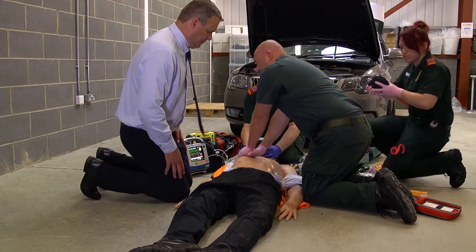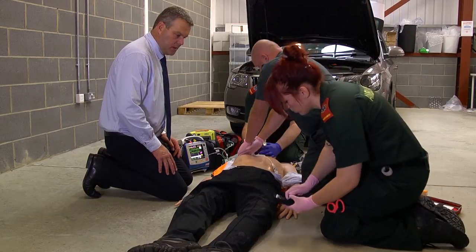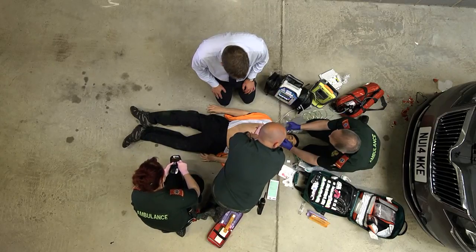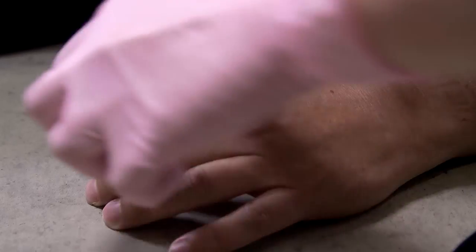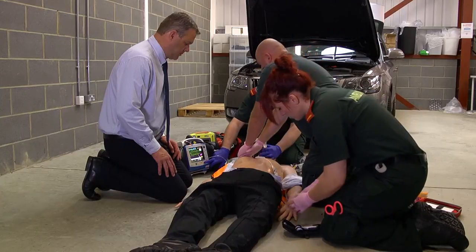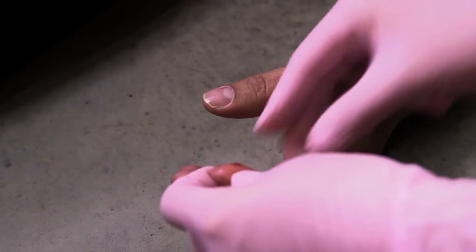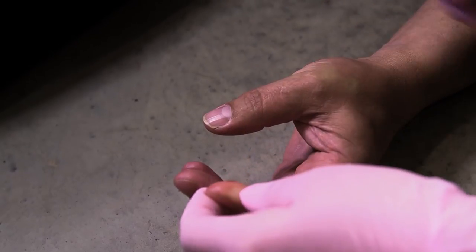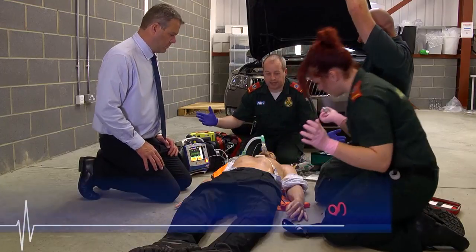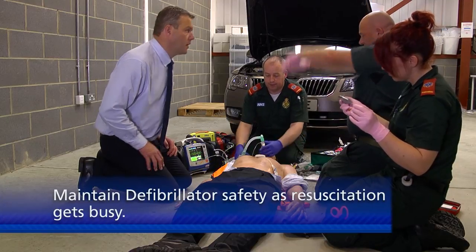In 30 seconds, yes, what I'll do is once we've delivered the next shock, we'll get you to take over. Steve, due to position, are you all right pre-charging and delivering the next shock? Absolutely, yes. So we've got 20 seconds left. I'll charge now. 15 seconds. So I'm going to charge 200, charging. 8, 7, 6, 5, 4, 3, 2, 1. I'm clear. Okay, everybody clear? Yep, Sean, clear. Are you clear? Clear. Delivering shock, still VF. Shocking. Straight on with the CPR.